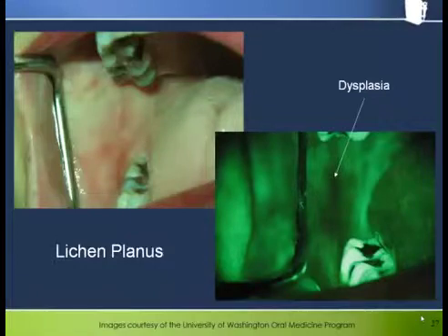This is lichen planus on the buccal mucosa. Notice how the inflammation evident under white light is better visualized as areas of darkness through the VELscope. Although somewhat controversial, chronic lichen planus is sometimes regarded as a possible pre-malignant condition, although only in about 1 to 2% of cases. Distinguishing fluorescence loss associated with inflammation from that associated with possible dysplasia could very well be problematic in a typical case of lichen planus. Research continues to be conducted in this area.